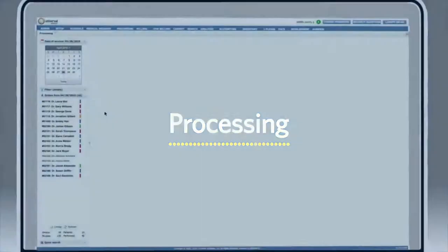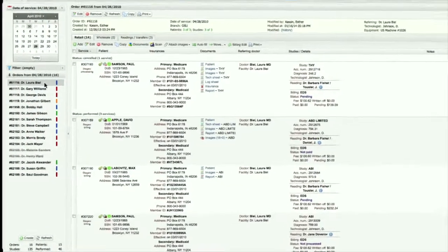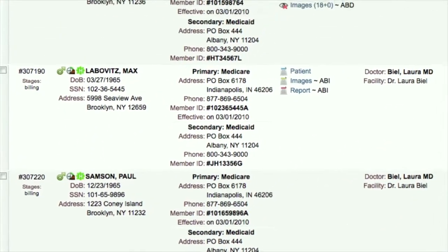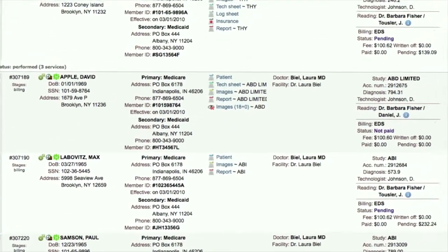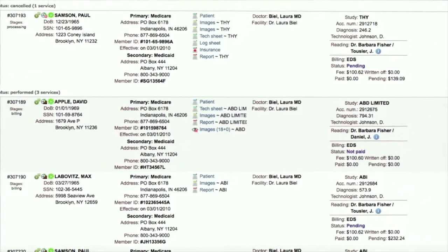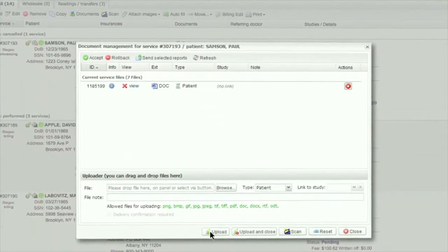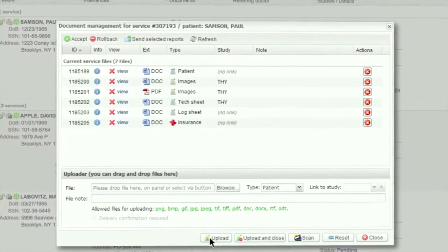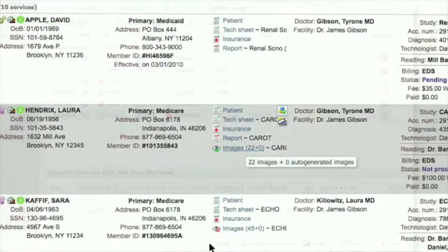EMSO automatically calculates who should read the test based on cost efficiency for your company and will recommend which reading doctor to use based on factors like patient insurance, type of study, and reading cost. You can also upload documents like test sheets, attach them to the patient and test, and send them with the test images to the reading physician.